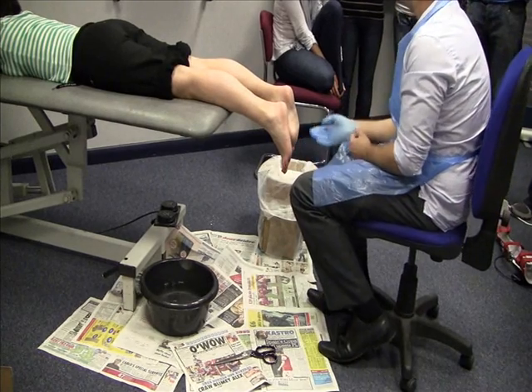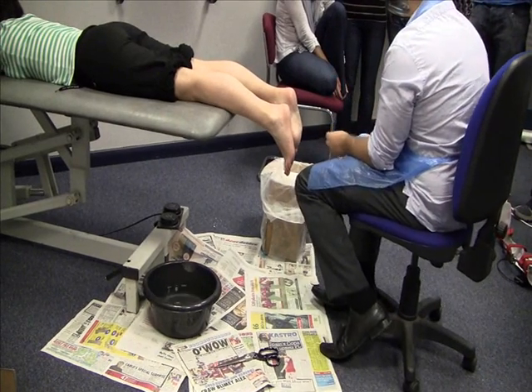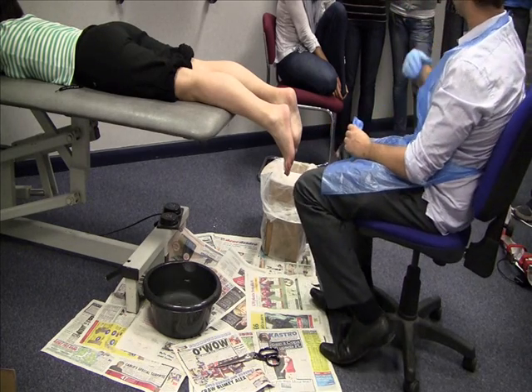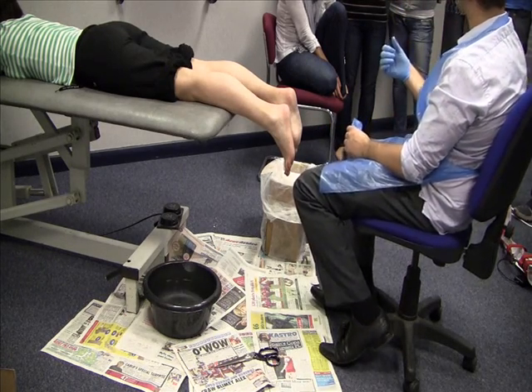Plaster casting. I prefer the patient on the front, mainly because with the patient on their back, I think there's a fatigue element that sets in.